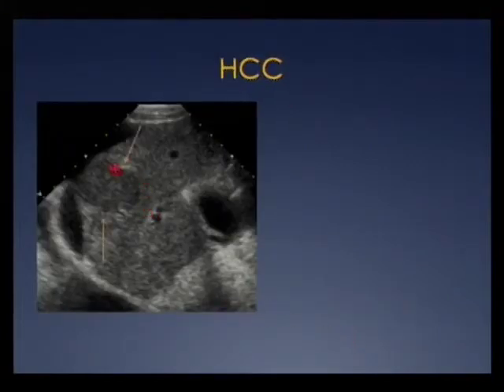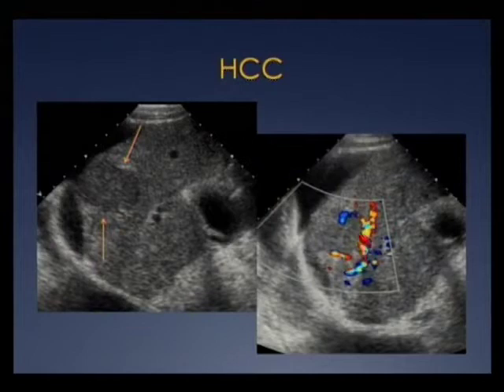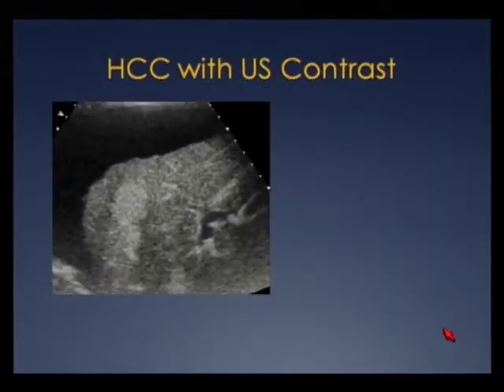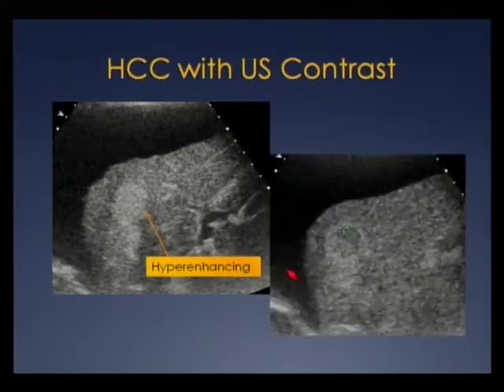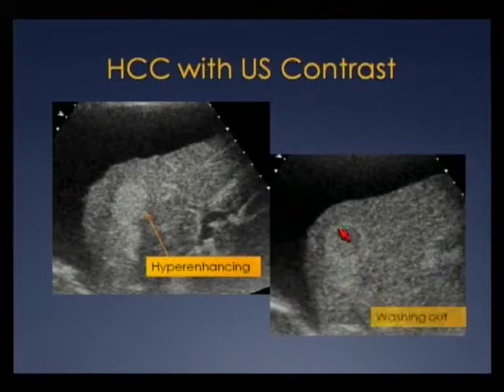Here's a hypoechoic lesion in the right lobe in a patient with ascites and hepatitis, showing increased blood flow — this is HCC until proven otherwise, and I would get MRI for confirmation. Here's another patient done experimentally with ultrasound contrast: in the early phase there was hyper-enhancement like on MRI, and in the delayed phase it washed out with residual capsule enhancement — another HCC.